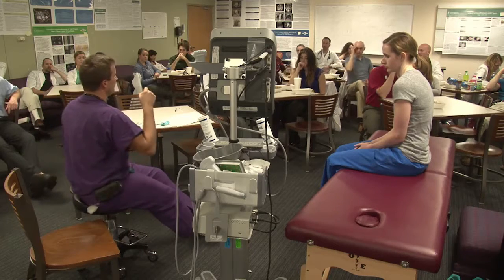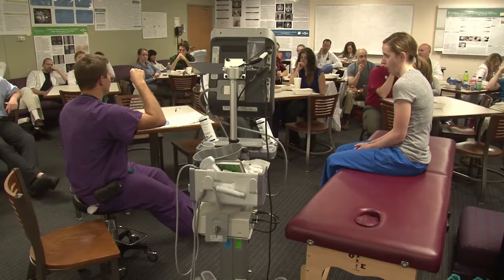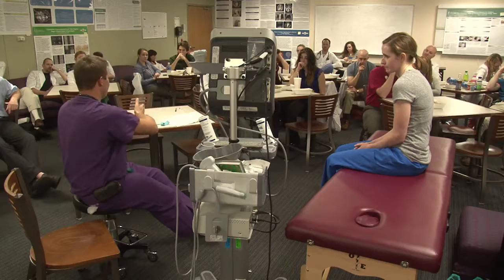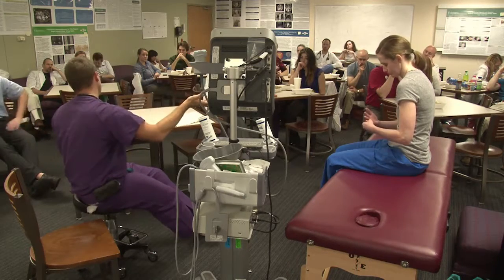And so one way that you can use to help see where the tip of your needle is, you're coming in, you look for that needle, that cross-section of needle shaft. Is it to the right of the vein? Is it to the left of the vein? Or medial lateral, I guess would be the appropriate verbiage.